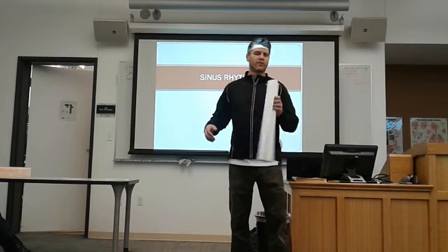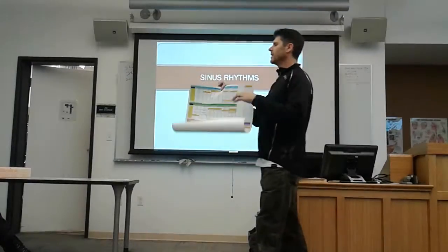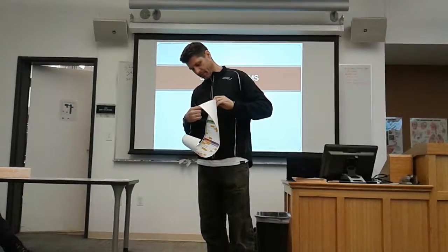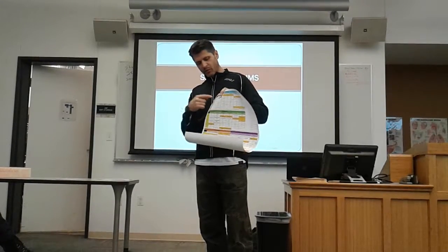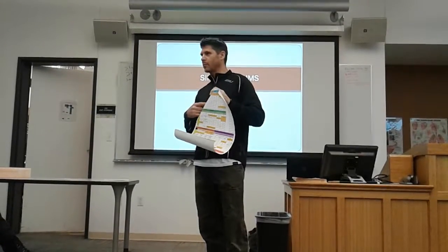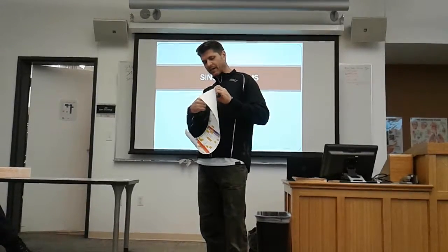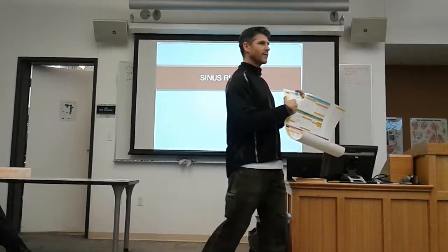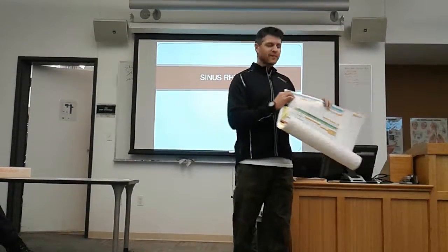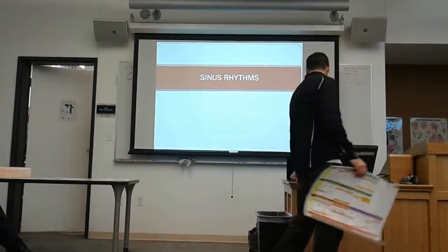It's similar to what I want you to do for the EKG as well. So on the EKG, I'll ask you to do an assignment where you are identifying all those things we just talked about: regularity, rate, P waves, the P to QRS ratio, the PR interval, the QRS complex, that kind of thing, all in a line, and you are identifying what that is for a normal sinus rhythm. Does that make sense? And I'll ask you to do that for every single type of rhythm that we have, which I already named.